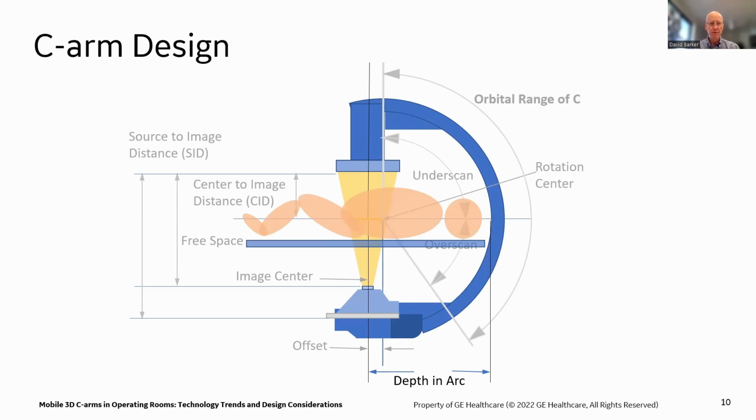It's an interesting number, but as far as clearing the patient, unless you're doing special procedures where you need to slide the C in to get to the anatomy, or you will find a certain set of surgeons, vascular surgeons, want this number to be semi-infinite. They don't articulate like other surgeons, and all they really want to do is scan the patient in all possible ways.